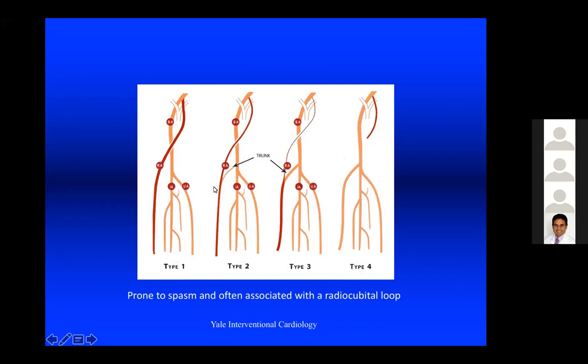Very often there's two arteries, one connection up here, and then there's a bridge over to the brachial in the usual location. It may be larger or smaller, but when you first start and you send the wire up, the wire may go up this accessory connection of the radial, and then you'll have difficulty moving the catheter.